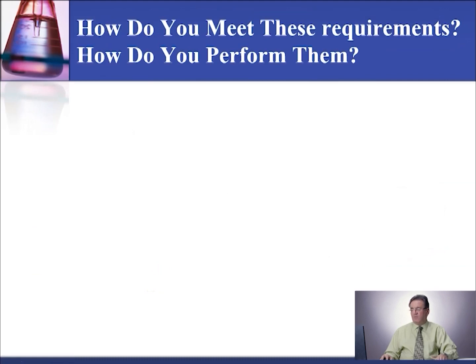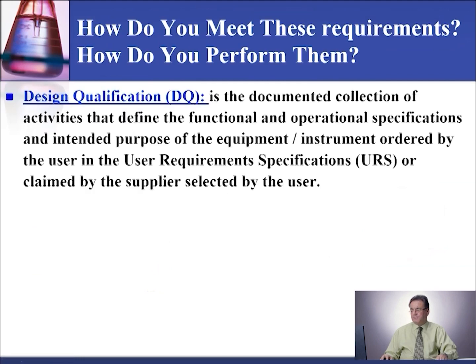PQ may include the following plan or activities. First, you need technical SOPs done for any test you perform patient results on for that section. The SOPs need to be approved by the medical director or designee and acknowledged by all the staff in the section.